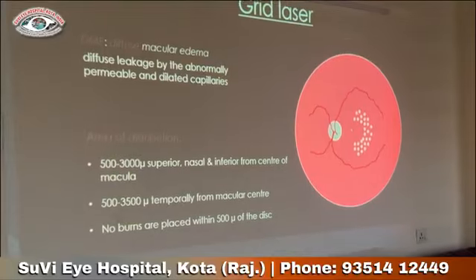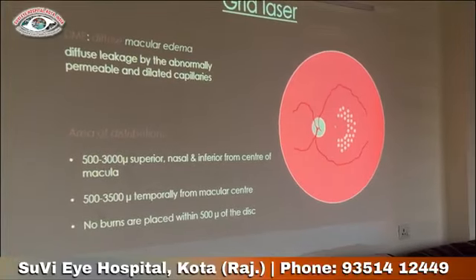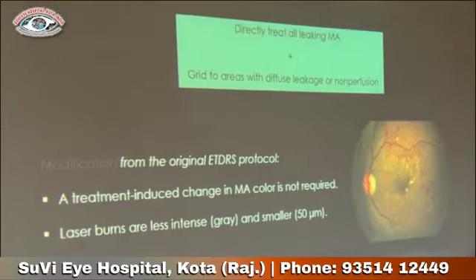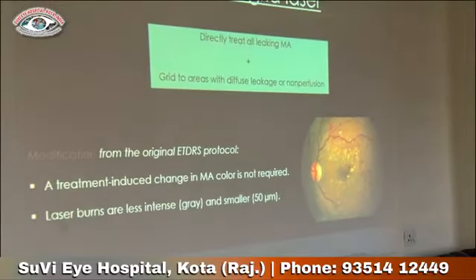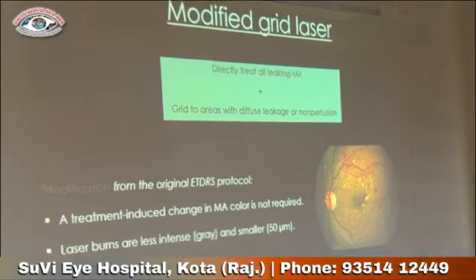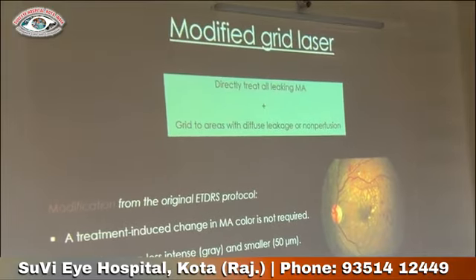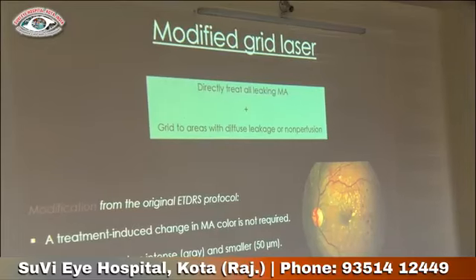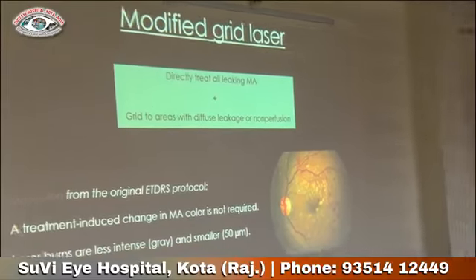This protocol has been replaced by modified grid laser. What we do is we don't treat the papillomacular bundle. We only do the laser in the superior, temporal, and inferior parts of the macula.